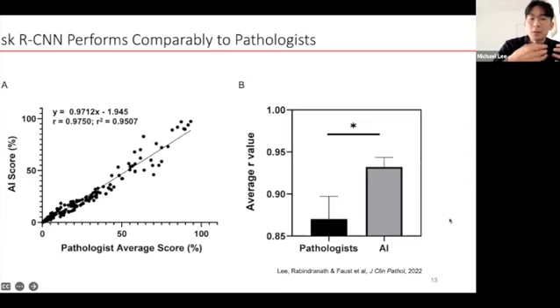And in fact, how the AI classified and quantified lay somewhere in the middle between the three different pathologists we had, with an average R value between the AI and the different pathologists somewhere in the middle, whereas the pathologists would have widely different criteria for how they quantified these nuclear stains.